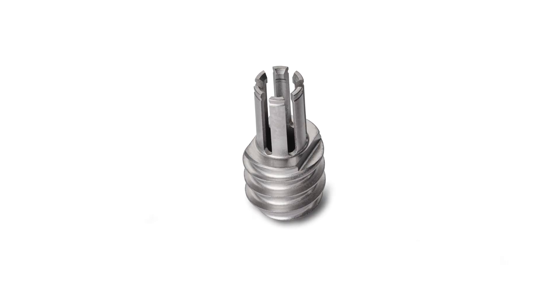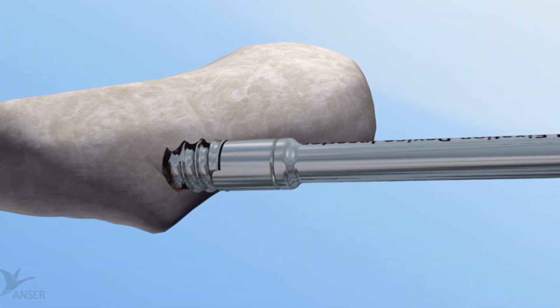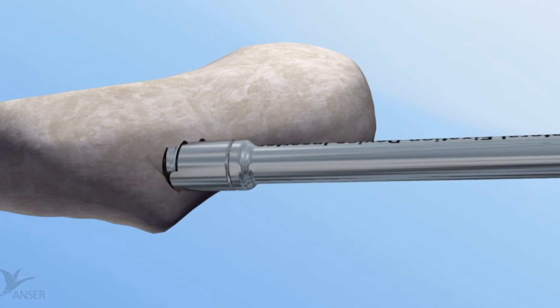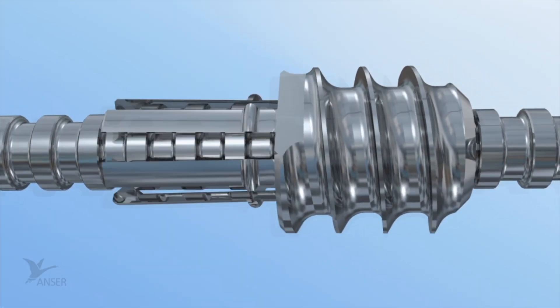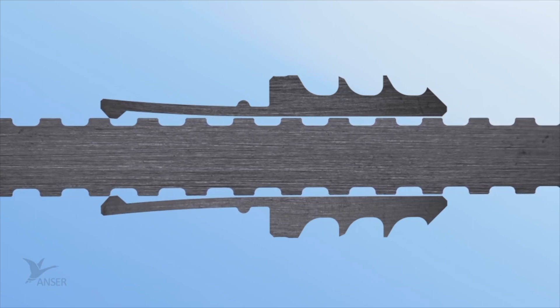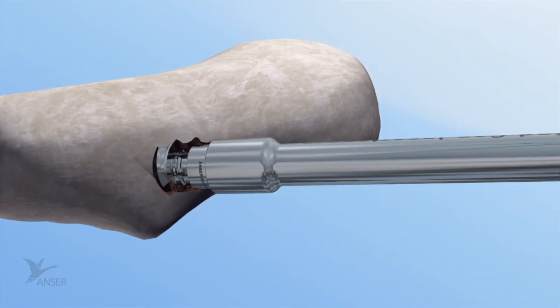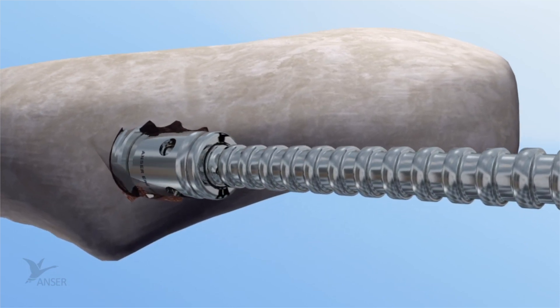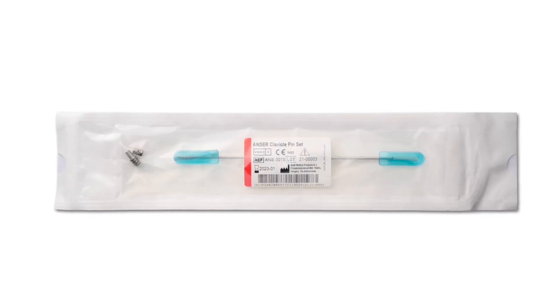The Anser lateral fixation device consists of a threaded exterior and six resilient legs. It anchors itself into the cortical bone of the lateral fracture element by means of the coarse thread, thereby creating the fixation point lateral of the fracture. Simultaneously, the resilient legs position themselves around the Anser clavicle pin in one of the previously mentioned indentations. These allow the surgeon to adjust the optimal length of the fractured clavicle and pin intraoperatively. Once the optimal patient-specific length and alignment has been obtained, the construct is secured with the Anser end cap. Once placed, the Anser clavicle pin is cut to length. The Anser clavicle pin set comes in a sterilized pouch in only one size.